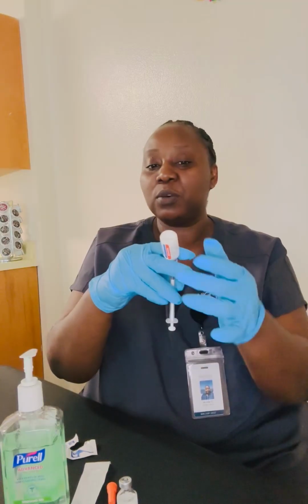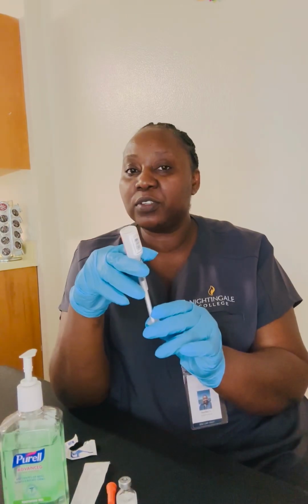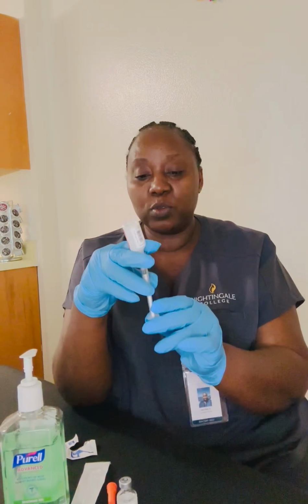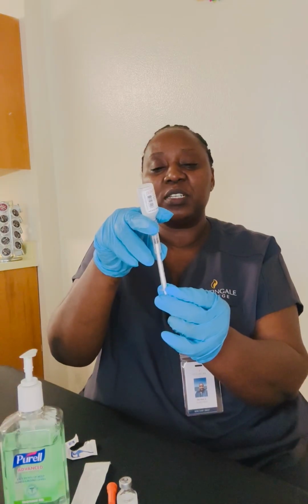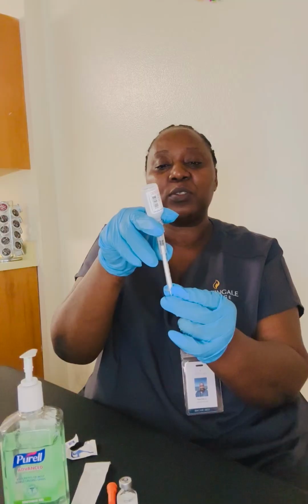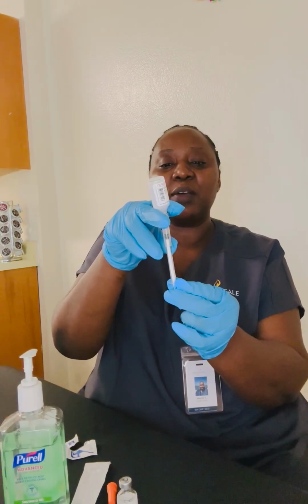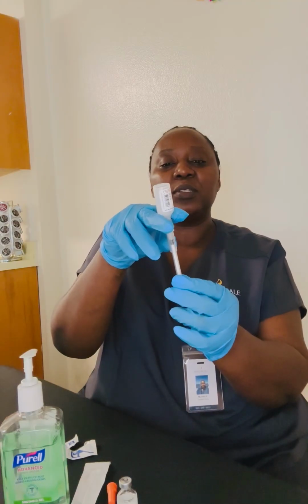For the 4 units that were done, we've already recorded that and signed off on it. At this point I'm going to draw up the 8 units, and everything will now total to 12 units. This one I'm going to draw gently because I don't want to draw up too much, so I don't have to push back in to get rid of the excess.